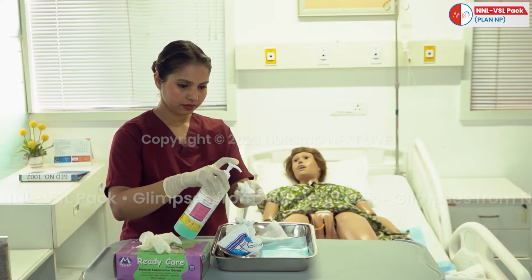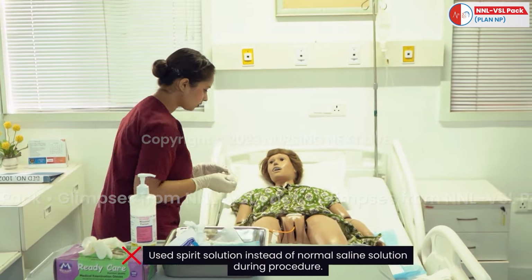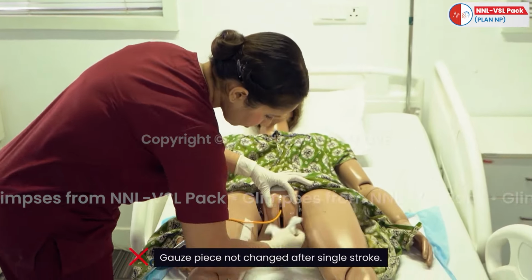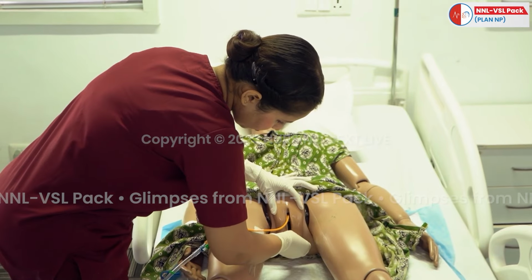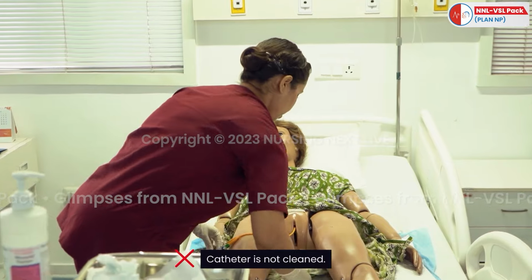Common errors. Use of spirit solution instead of normal saline solution during procedure. Gauze piece not changed after single stroke. Catheter is not cleaned.